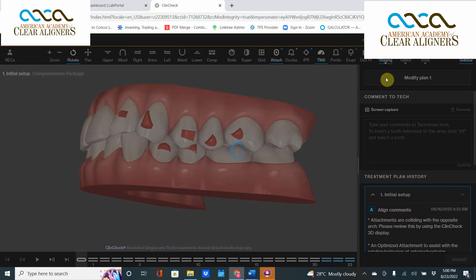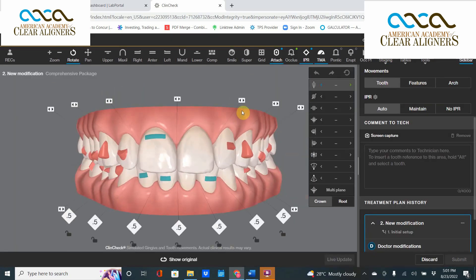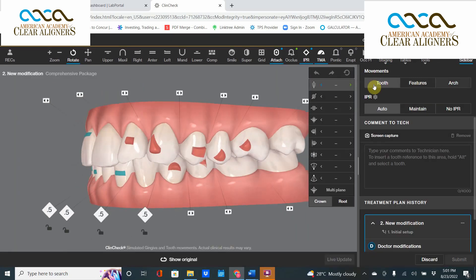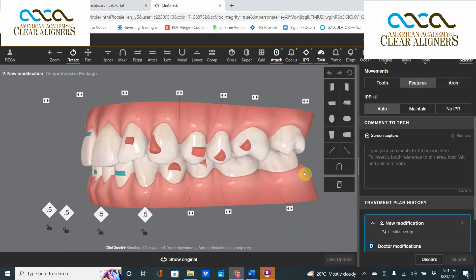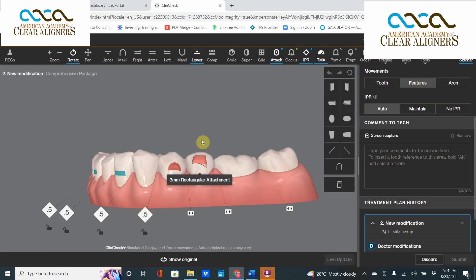These attachments cannot stay like that — you have to remove them. The way we do that is we move to Modify Plan, go to Features, and then in Features we take that attachment and try to move it.